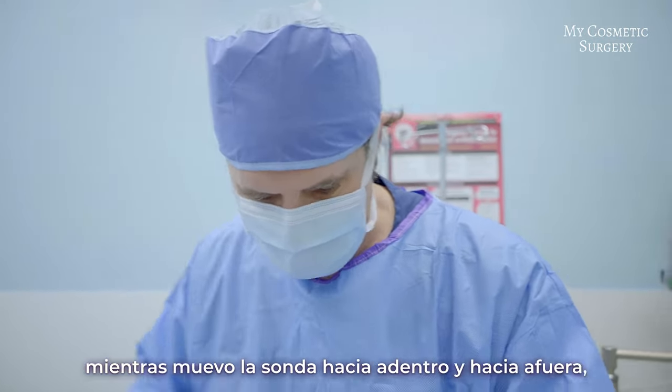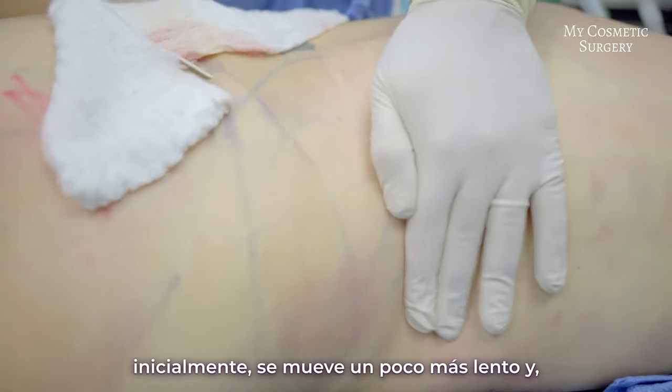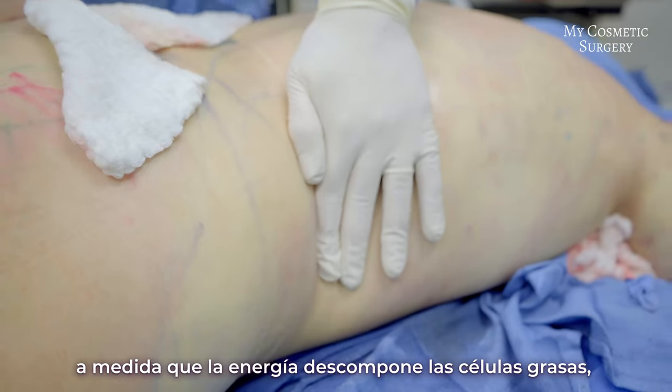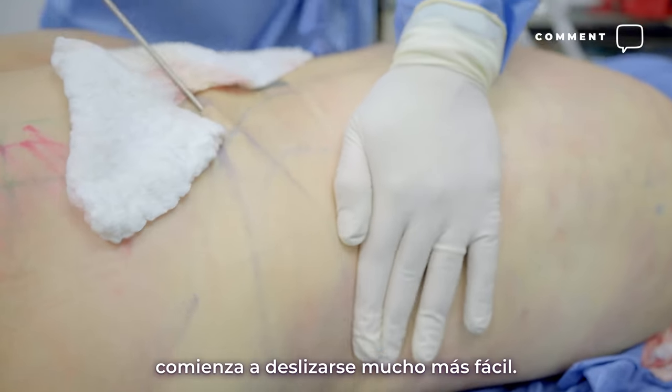You can see as I'm moving the probe in and out, initially it moves a little bit slower, and as the energy is breaking up the fat cells it just kind of slides in and out like butter.